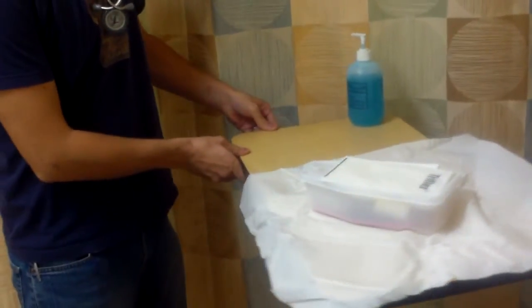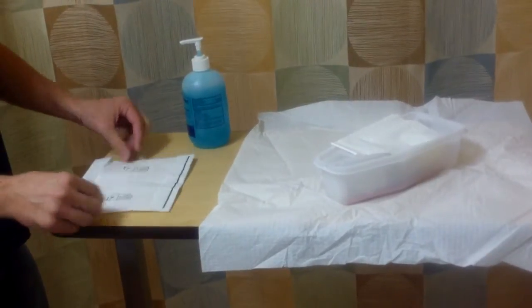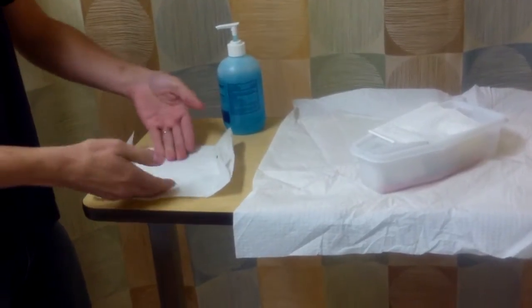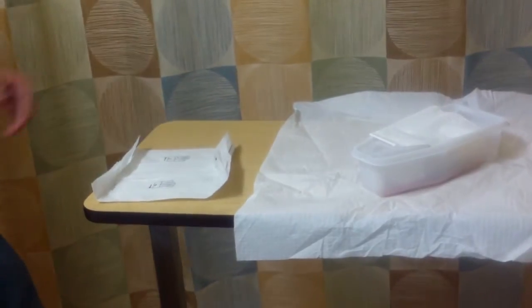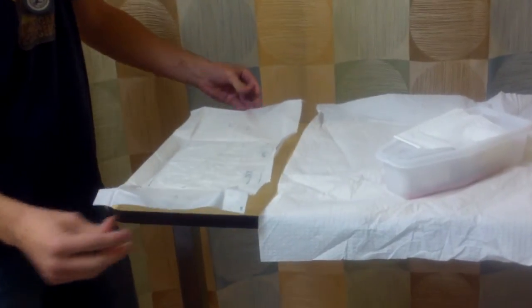Next, I'm going to be putting on my sterile gloves. So I'm just going to switch this around so you can better see. Grab my sterile gloves. Okay. Open them up like this. And then I'm going to ask if it's okay that I close your abdomen. I would have my curtain closed for privacy there.